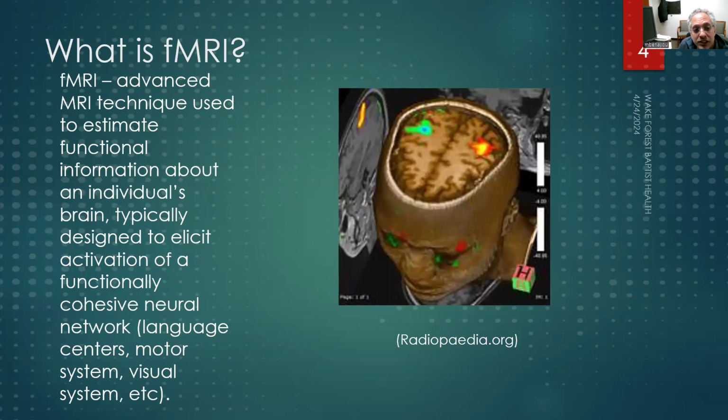So this is a functional technique, and it's used to figure out information about where in a person's brain certain functions are located. Most of us have taken neuroanatomy, and we've learned that Broca's area sits in the inferior frontal lobe in the language dominant hemisphere, usually on the left. You can sort of know that Wernicke's area sits in the posterior aspect of the superior temporal gyrus or supramarginal gyrus. But that's a population comment, meaning that an individual with a brain tumor in a certain location may have remapped language, particularly if they were young and had plasticity present.